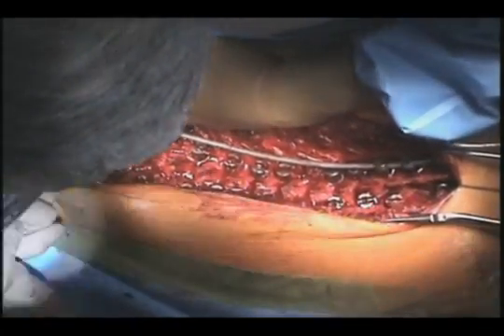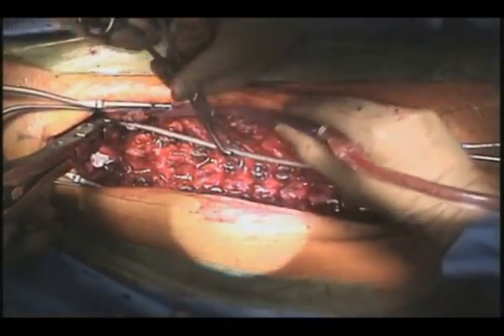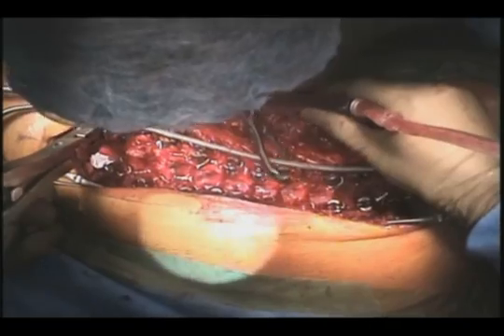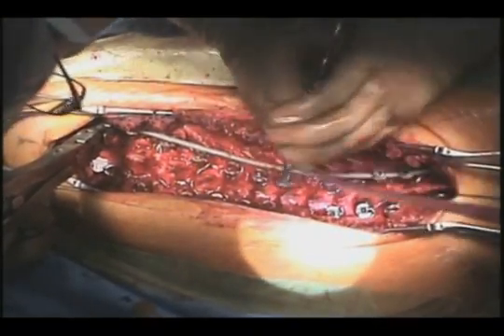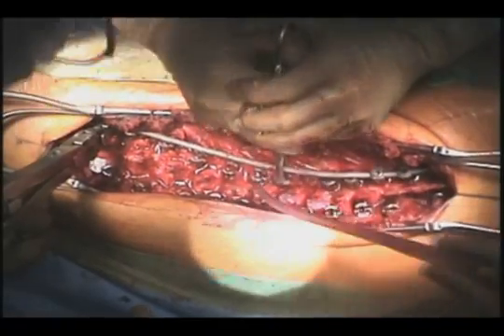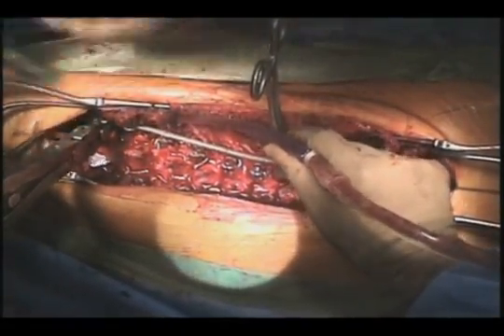And we'll use the old-fashioned hook holders to pull the spine to the rod. And this really just allows us to straddle the pedicle screw and the rod, and it pulls the screw which is attached to the spine over to the rod.